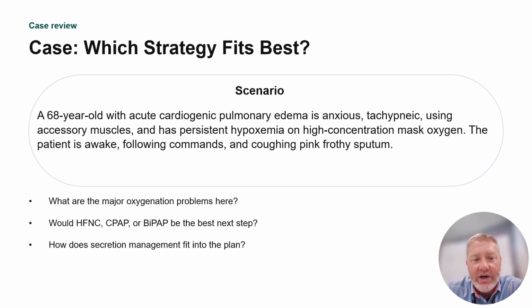So I'm immediately thinking positive pressure. I'm ruling out all low flow devices. I'm ruling out high flow nasal cannula because that is not most appropriate for fluid. So we want positive pressure, so positive airway pressure or PAP, to push off the fluid to allow for better ventilation and oxygenation.